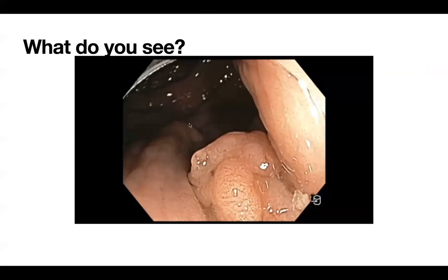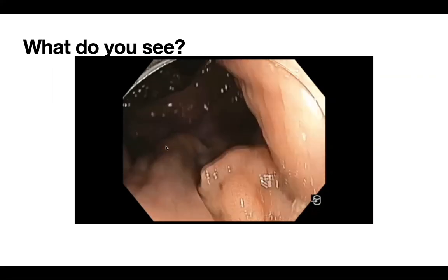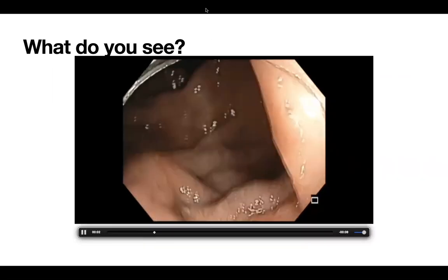I would like to ask Zubair to comment. We wanted to make this a session where the fellows would get the first shot to comment on this. And let me play this video. This is just above the dentate line.